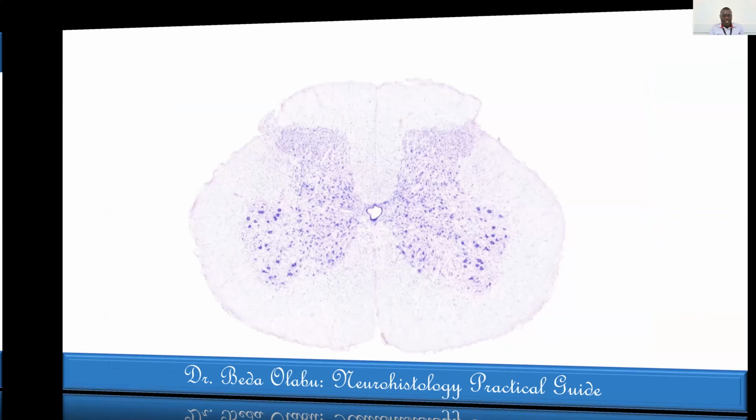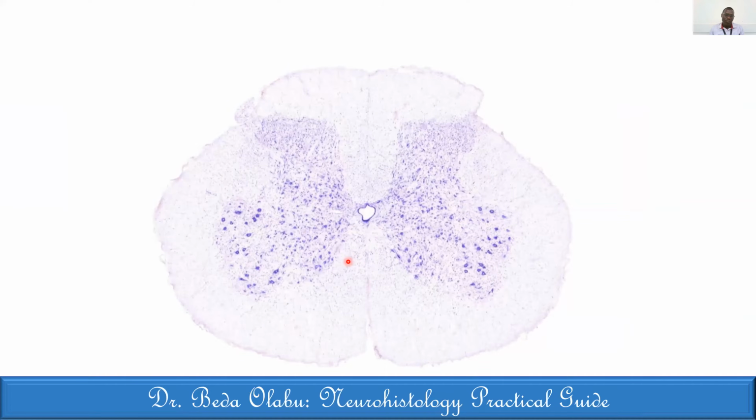All right, another slide. This one is a cheap one. Anyone to give us a trial on the identification of this one? Just put a hand up, I'll enable your mic. This one, if you don't identify, we skip it. It's very cheap.